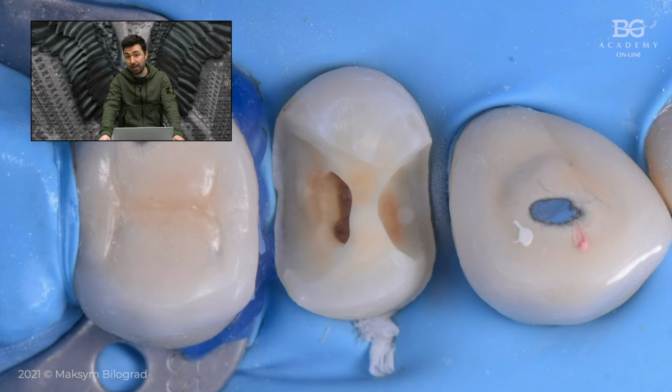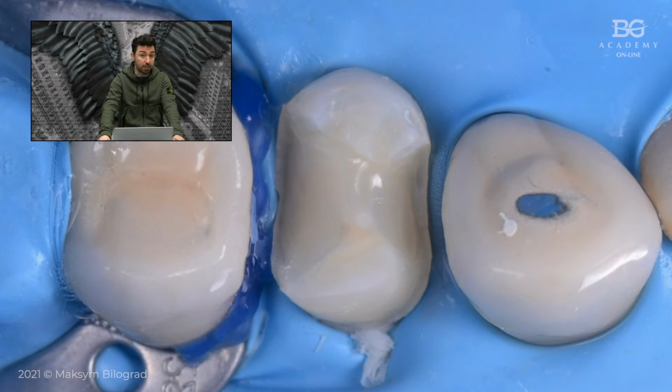You can see now enamel from the distal side. The wall was removed after we finished our endodontic treatment. We sandblasted, we provided core build-up, and then we finished our preparation.